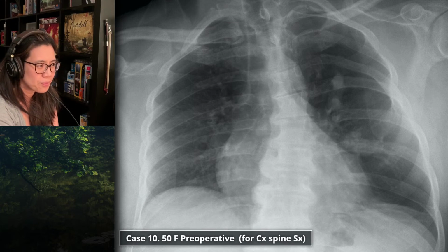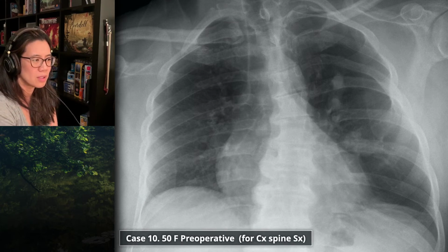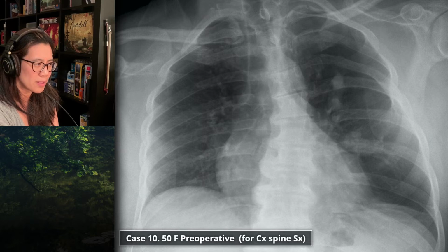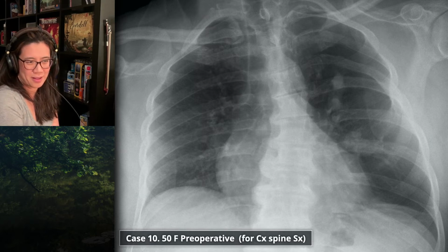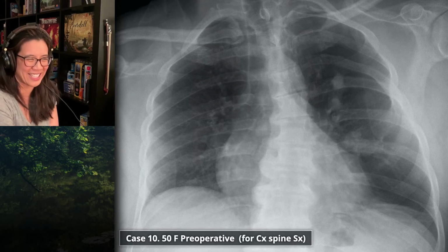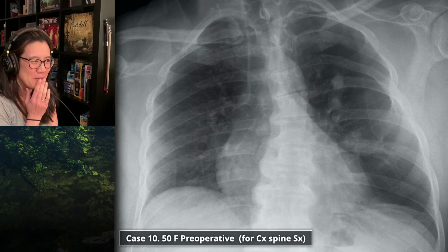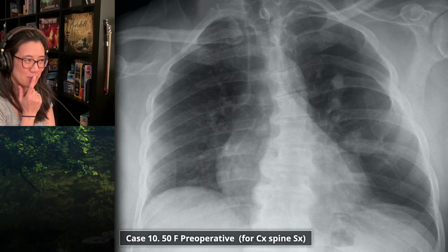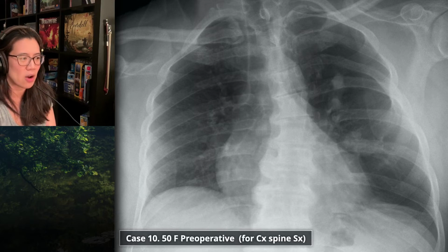I don't know whether it's the JPEG, but I'm not getting a distinct Harlequin feel to this X-ray as I look at it. I think maybe the right side is slightly denser than the left, but I'd be hedging my bets, and I don't know that I would necessarily prospectively call it if you weren't telling me that there was asymmetry. I wonder whether, I take that back.